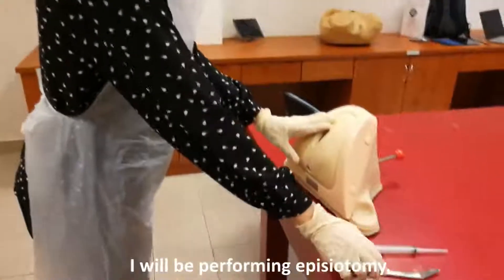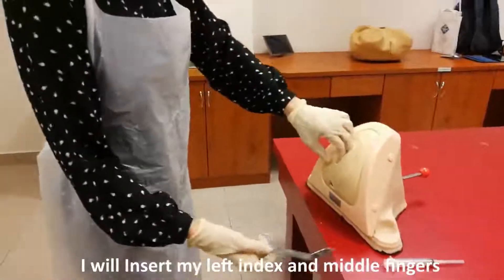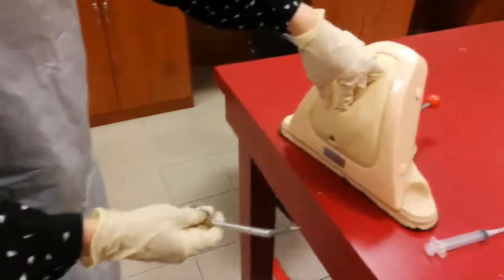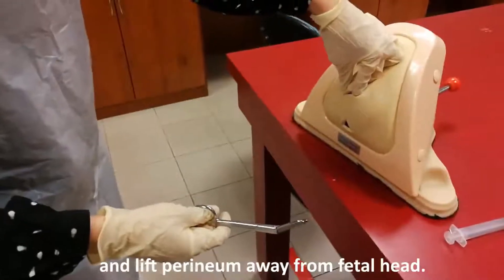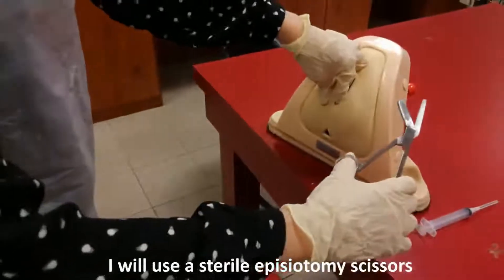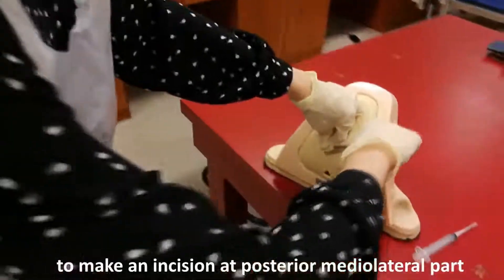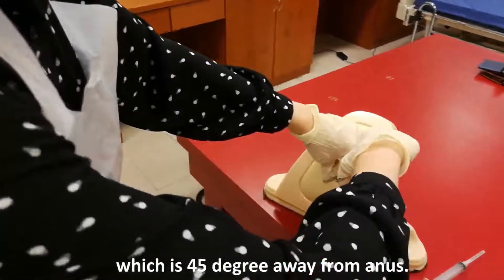Madam, I will be performing episiotomy. I will insert my left middle and index fingers into the vagina posteriorly to protect the fetal head and lift the perineum away from the fetal head. After that, I would like to use the sterile episiotomy scissors to make an incision at the posterior mediolateral part, which is 45 degrees away from the anus.